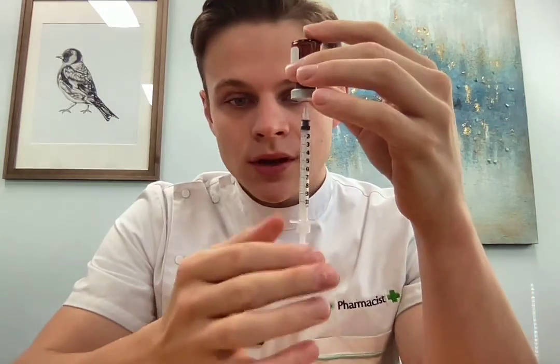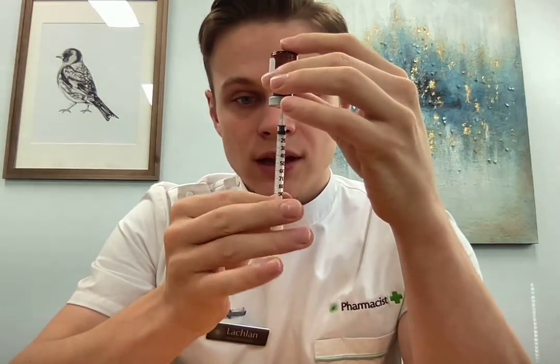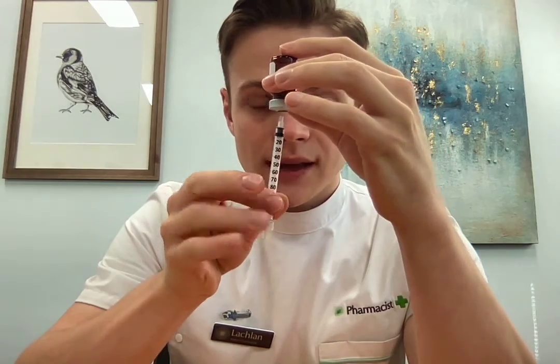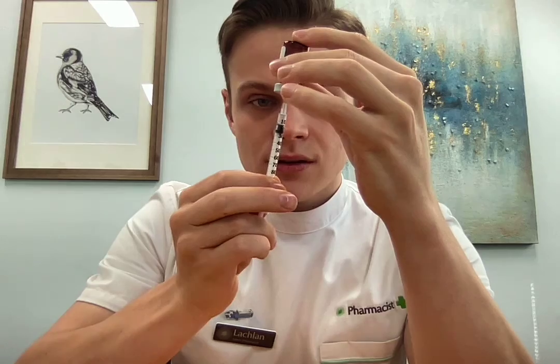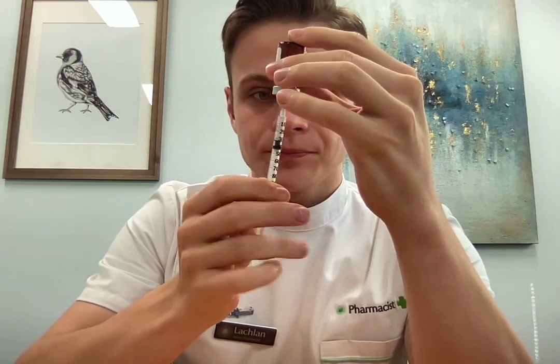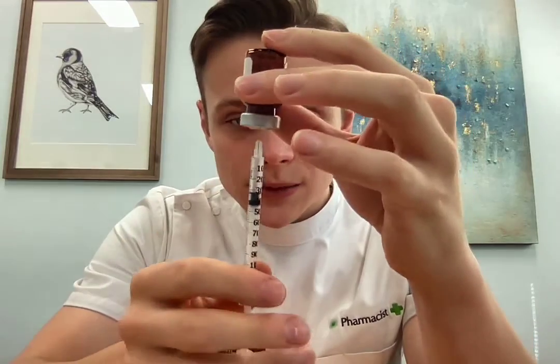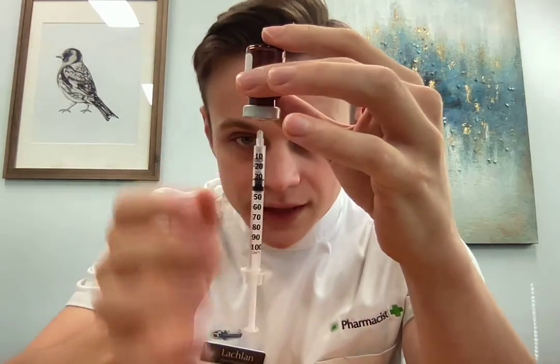To draw up the dose, hold the body of the syringe and then with your other fingers, pull down on the plunger — just go straight down, making sure to keep the needle straight. I find the easiest way is to overdraw. So I've drawn down to 30 units. Overdraw, keep an eye on the dose with your eyes level to the syringe, and push straight back up to the dose that you want. In this case, I'll do 10 units.